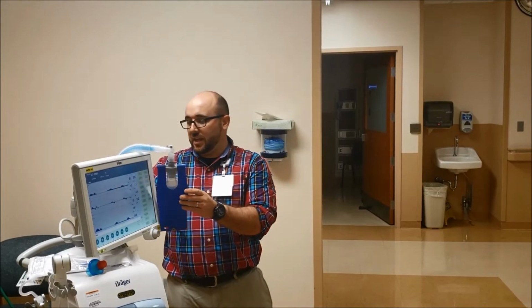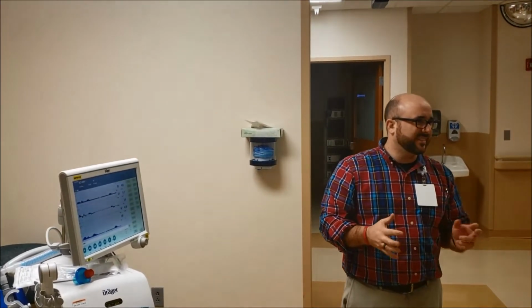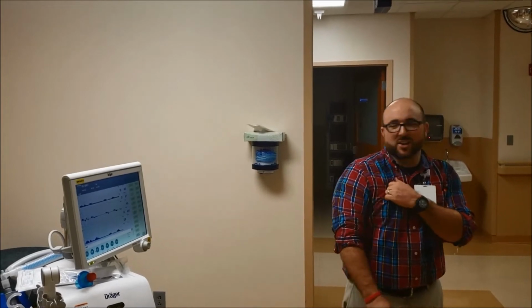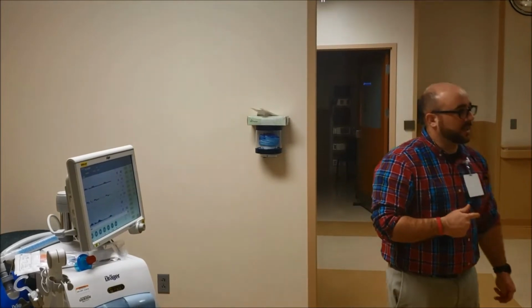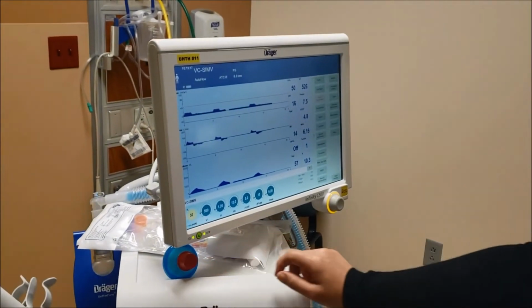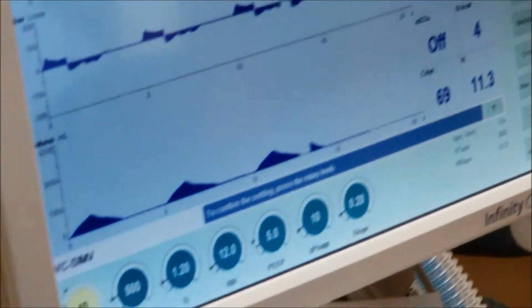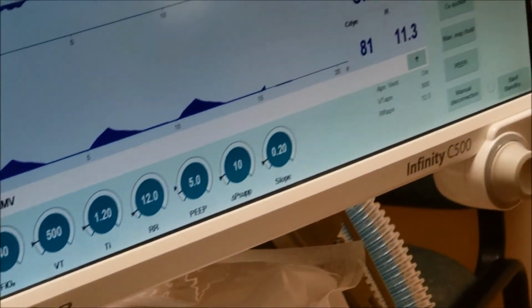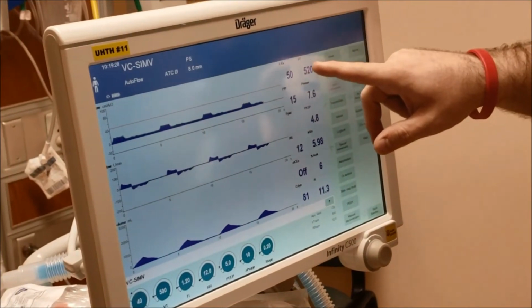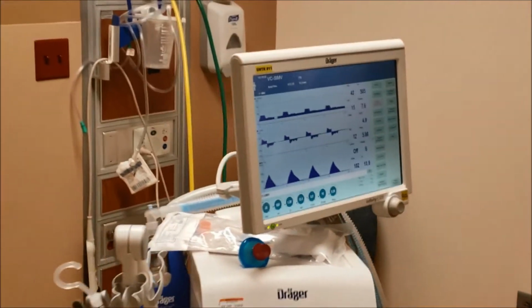Okay, so let's say that you need to wean your oxygen. So I don't know, do you guys call it wean oxygen? You wean oxygen? Okay, good. So, oxygen's right here. So go from 50% to 40%. Touch, adjust, and confirm. Bingo. So you're going to see this is your measured value. That's going to slowly start going towards 40. That's exactly how you do it. So then you need 15 minutes or so before you can draw a blood gas after that change.